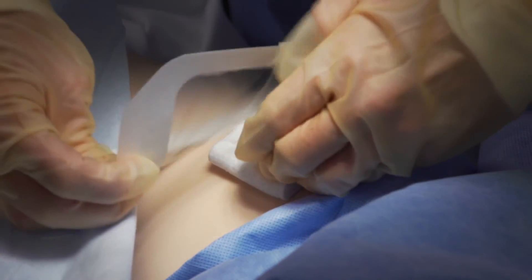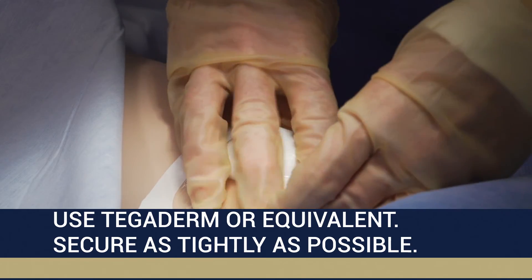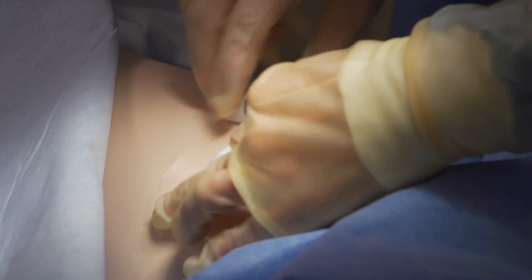Without moving or lifting the pad, apply an adhesive bandage or equivalent over the pad while maintaining manual compression on the pad. Secure the adhesive bandage to skin.